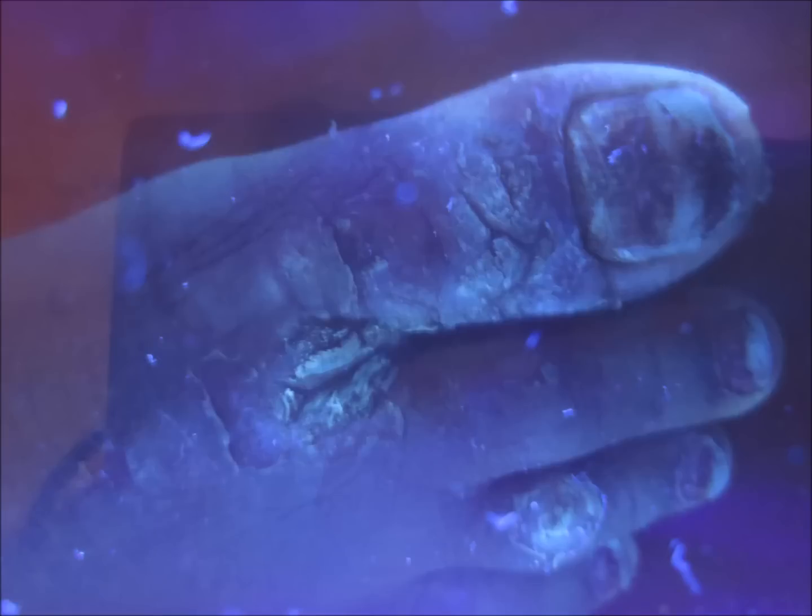Under UV light, you can see the thickened skin — actually it's the dead skin — which is looking whitish under UV light. This is how it looks. Some of the reason for it appearing light green under UV light is that the green color is not being recorded by the camera; the camera is showing it as white.